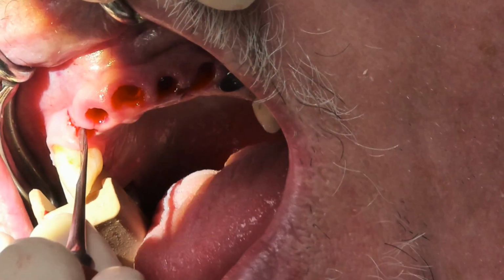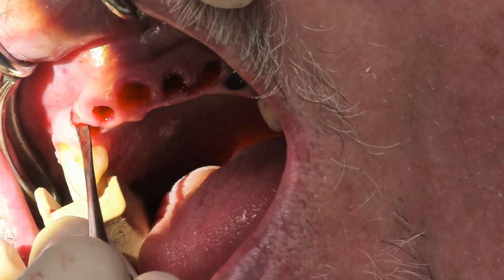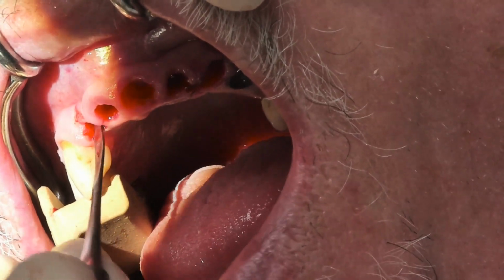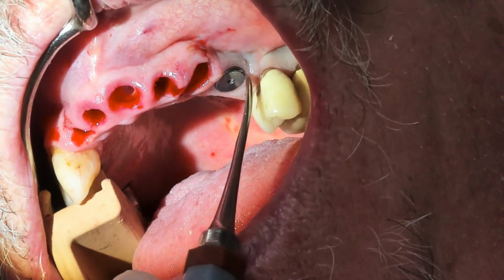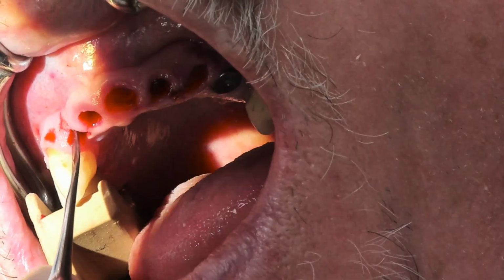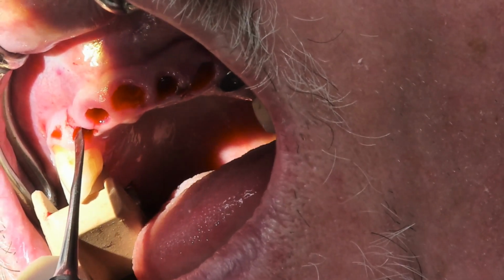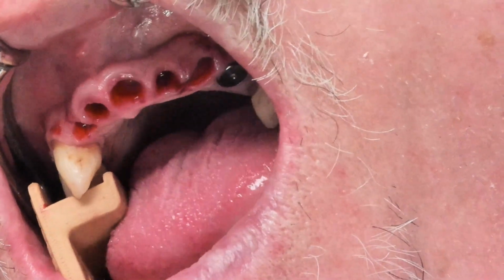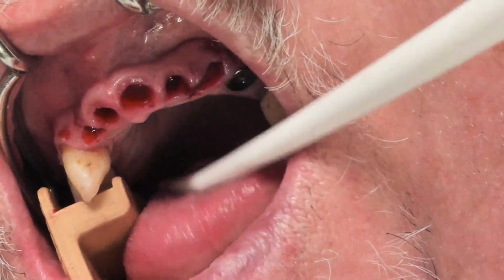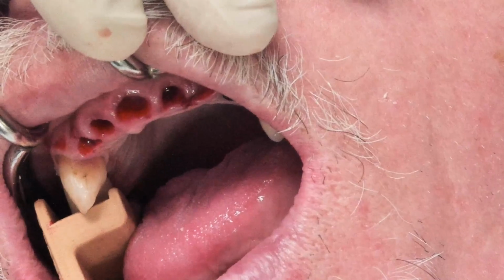But let me show you that this is an area why it's critical for zirconia implants. You see what happened here, just in me evaluating the buccal plate, we've got this little crease in the tissue. Titanium is a concern, of course, because of the translucency through the tissue. Look at the titanium healing cap, and you can see the silver. This is an area where we would have to be really concerned, possibly do a connective tissue graft in addition today, but you're going to see what happens as I treat this with the zirconia implant and the abutment collar. That lack of translucency through the tissue, in my opinion, is critical in the aesthetic zone. This is why, in my practice, maxillary anterior sextants, among other places, are all zirconia implants at this point.